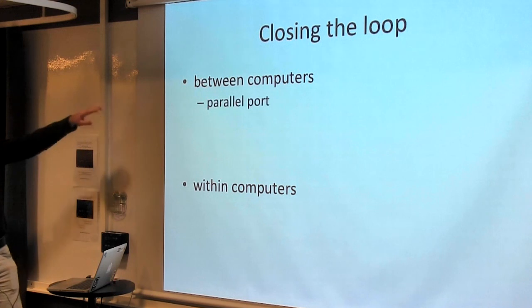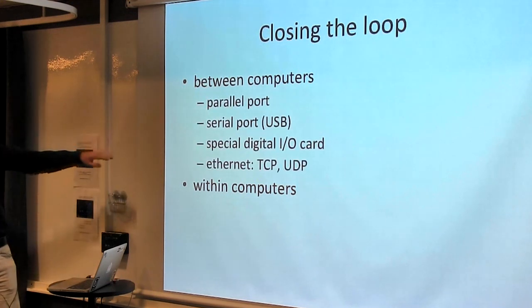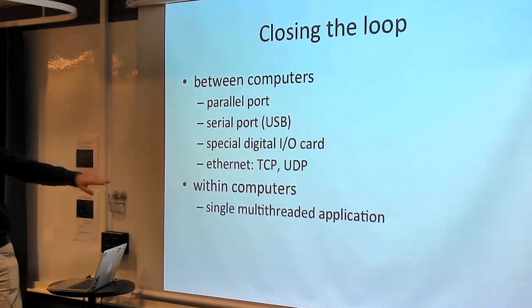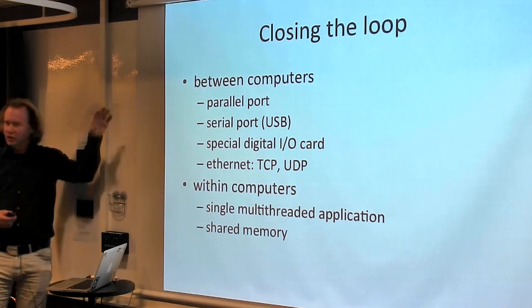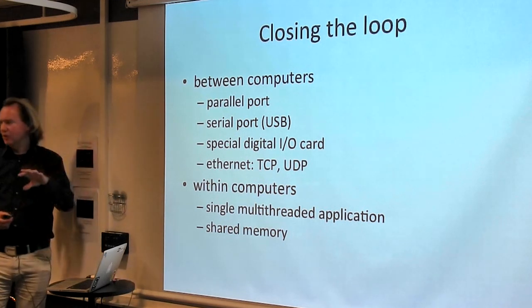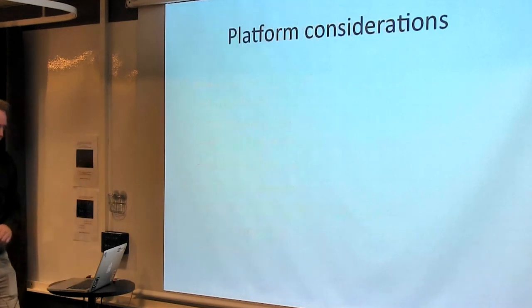Between computers we have these options and Ethernet, and within computers we have single multi-threaded applications, so we can use shared memory, for example. So there are many options possible here, but it really depends on the application that you're trying to build. Well, yeah, you could also use TCP sockets.